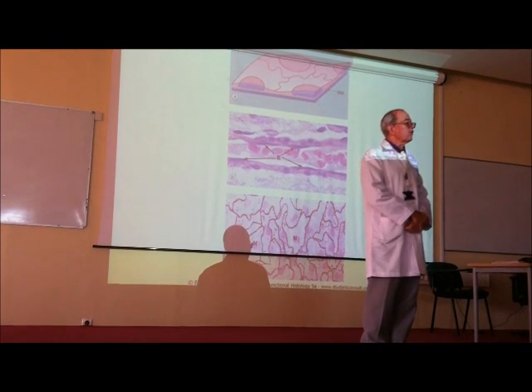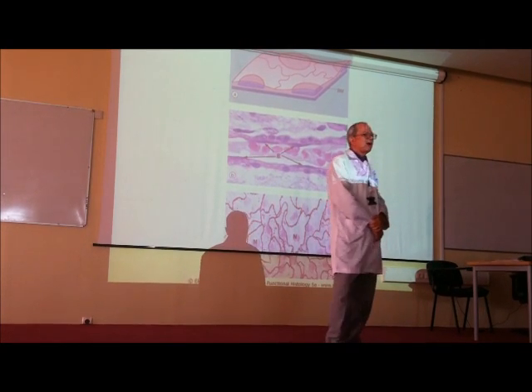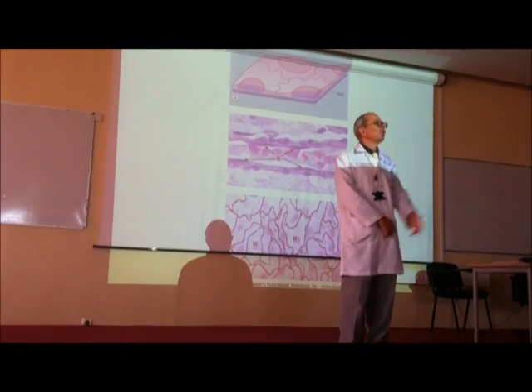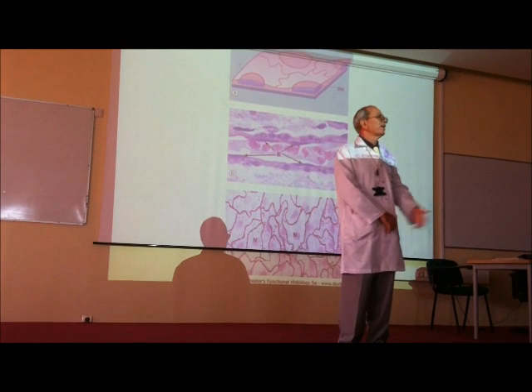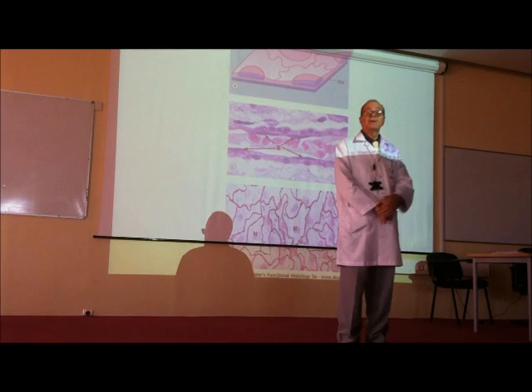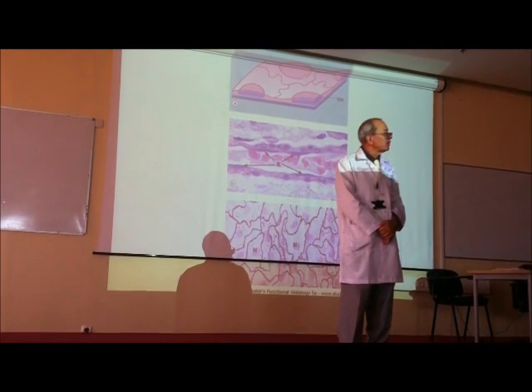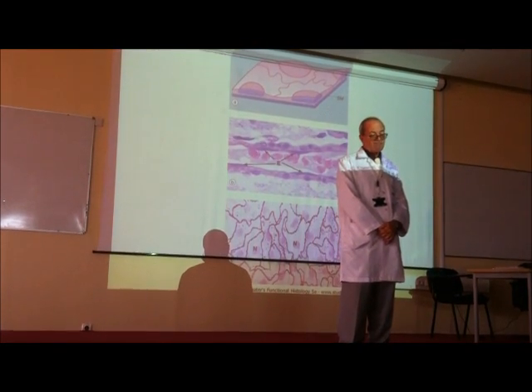I start to give you some questions. Shape of the nucleus. I will write flattened, oval, rounded, lobulated, irregular. You will choose flattened. Present lines: I write blood vessels, serous sac, stomach, esophagus, whatever. What do you have to select? Blood vessels. What else?